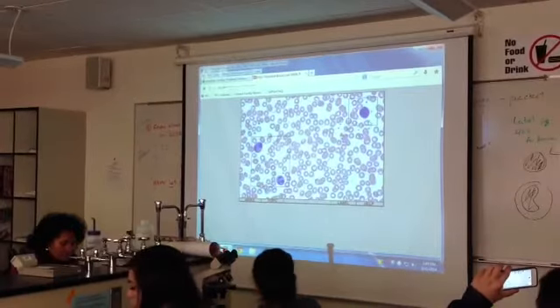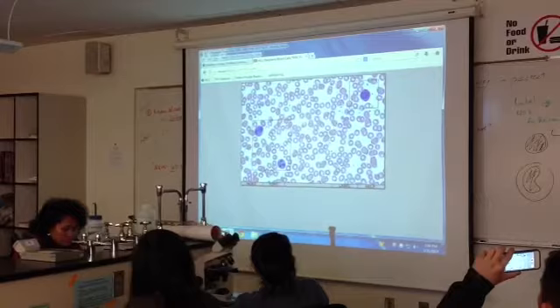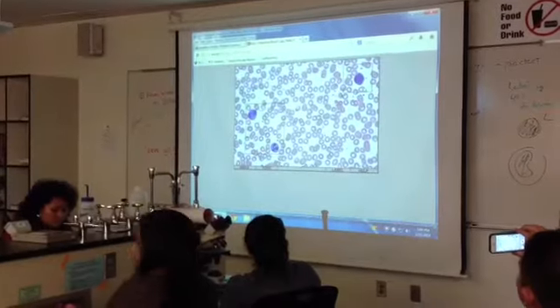Yeah, it just looks distinctly different. Hard to say. So does the eosinophil always have 2? Yes, it should have 2, kind of shifted like that. Yes? Okay.